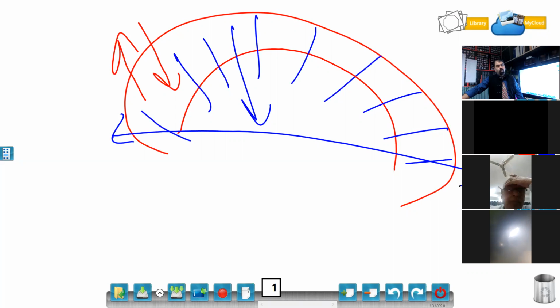Now there can be a focal pyelonephritis also. Keep that point in mind, because that will look like a mass. That will look like a mass. So there is something which is called focal pyelonephritis.